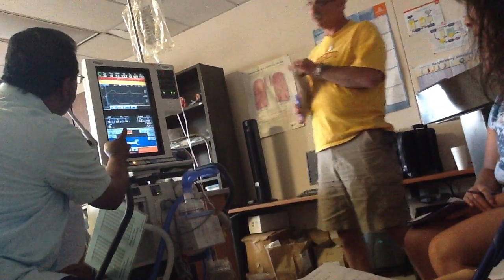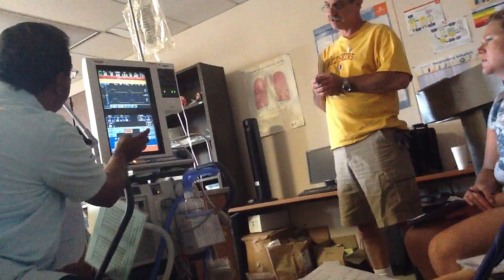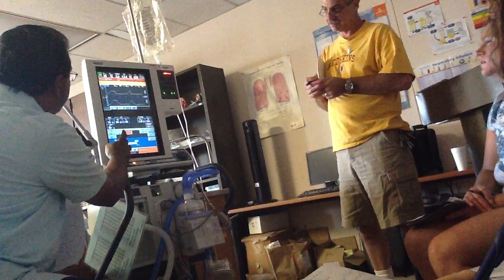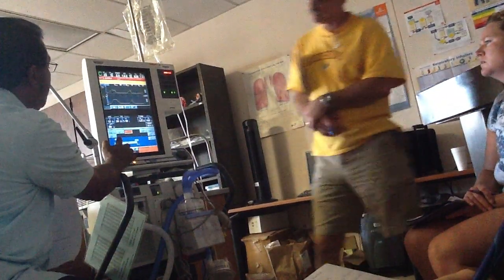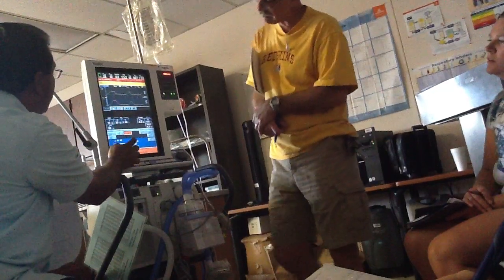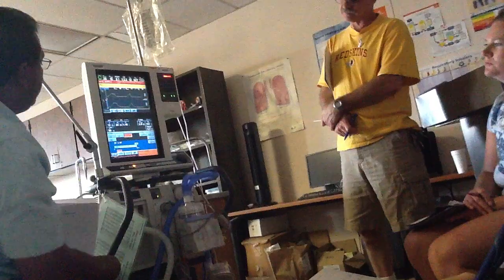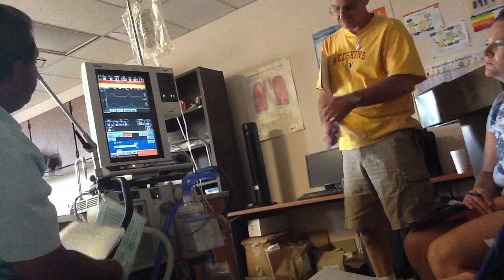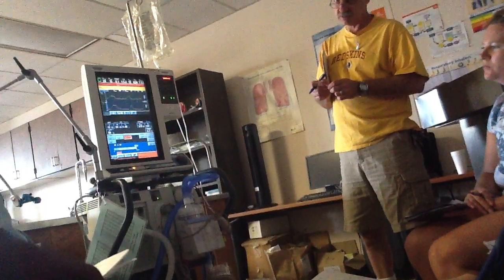Well, if we wanted to learn the way you're trying to teach us to learn, let's leave it unlocked and just keep messing with the TI. Yeah, I just want to show you this is how you lock it. See, lock it and unlock it. Locking the IE ratio. See that lock button pointing down to 1 to 4? Yeah. That means it's locked.